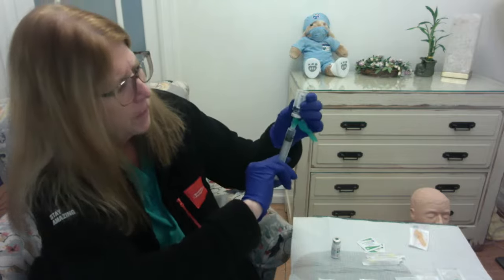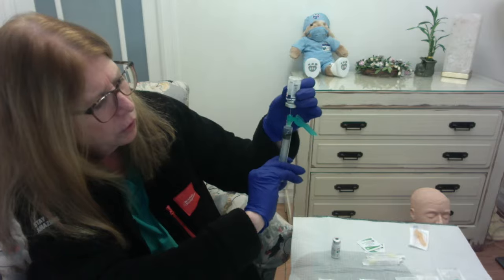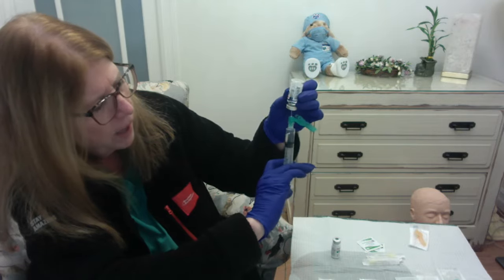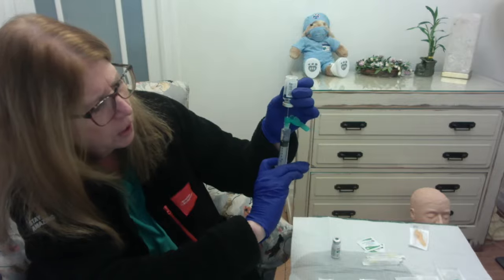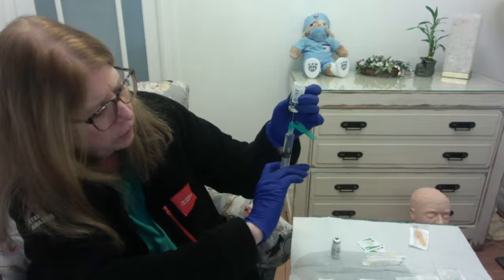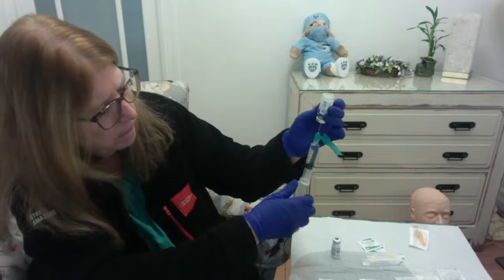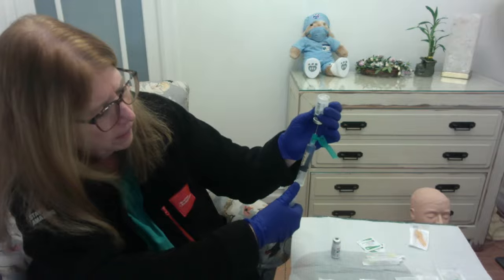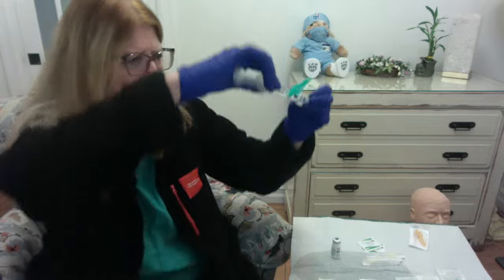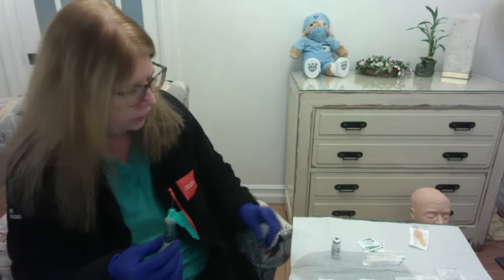Flip over, get your needle below the level of your fluid, and you're going to start to see your plunger is coming out by itself, and you are filling your syringe with that diluent. So let's get us to the amount that we need, right? Let's pull that back a little bit. Okay, so I have got my amount. I'm going to invert back, take my needle out, set the diluent to the side.